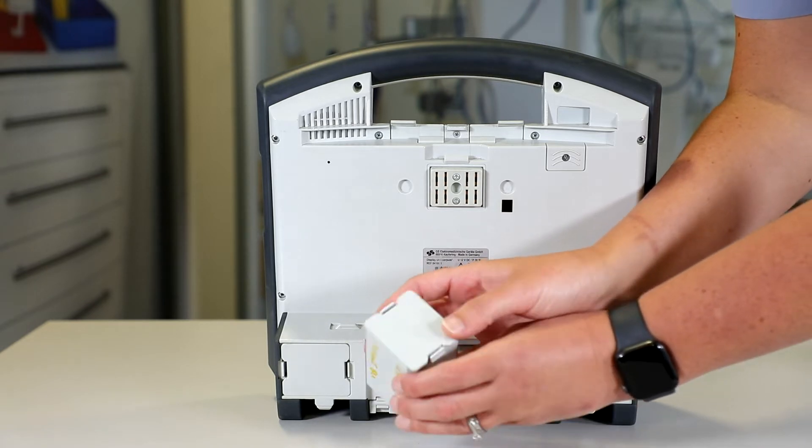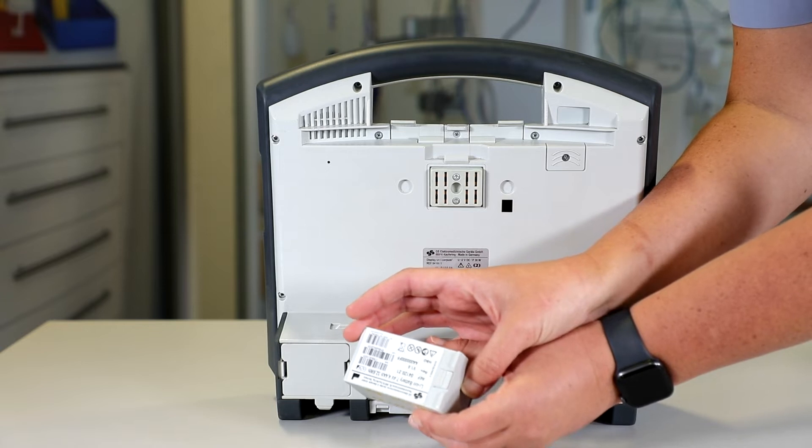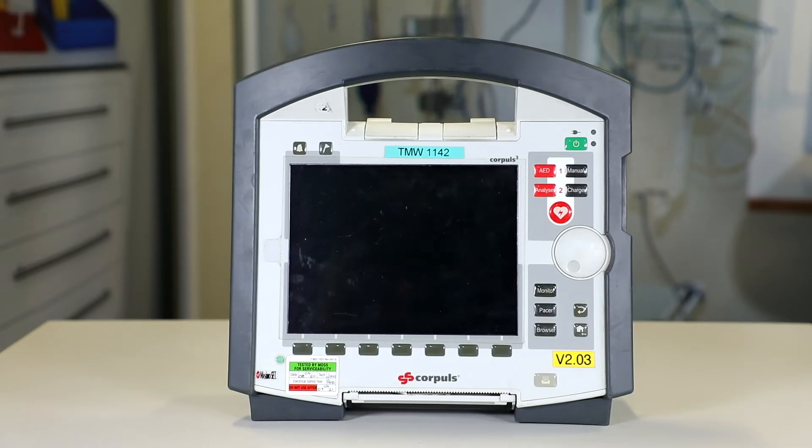These batteries have to be replaced every three years and that's MDSS's responsibility. It's also worth noting that depending on how the Corporal is configured — whether as a whole unit or split into component parts — affects battery capacity. The monitor has a projected running time of four hours, the patient box four to six hours, the monitor and patient box together six to eight hours, and all together seven to ten hours. The defib will give you 200 shocks at 200 joules. Battery charge status is displayed on the main screen; it takes one hour to reach 80% charge and two hours to reach 100%.